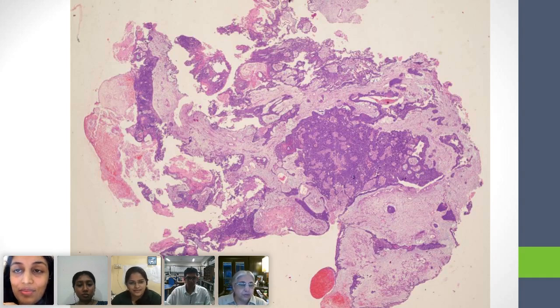Yes. So now that we had this little side discussion, can you now look at this and just tell me what you're seeing at the scanning lens? Oh, ma'am, we can see predominantly... You're marking, but when you're describing something, you're describing it to yourself. In your brain, you cannot mark something. And as I keep saying again and again, a good descriptor, somebody who's making a description, should be so good that that person can be my eyes.